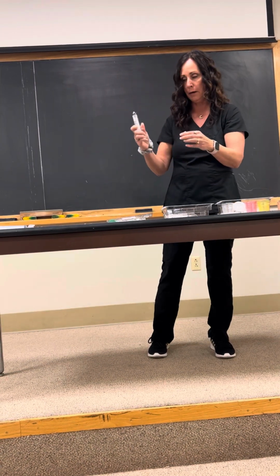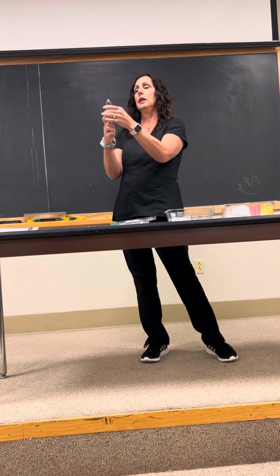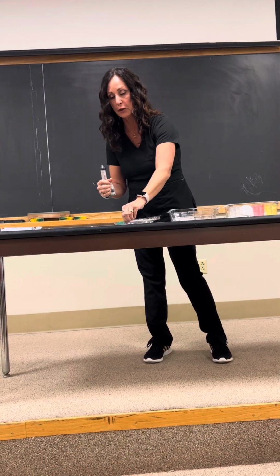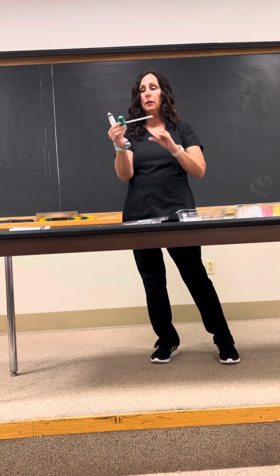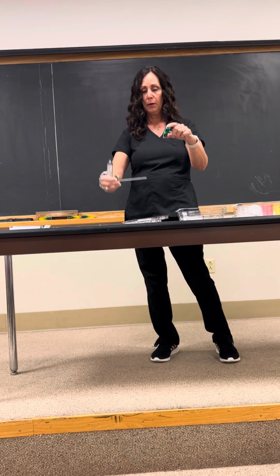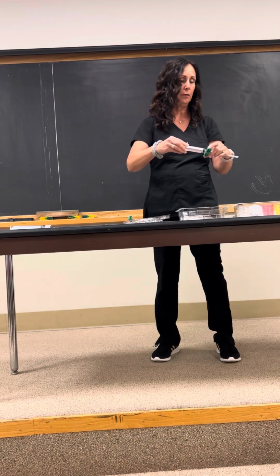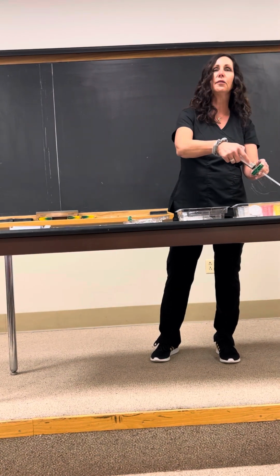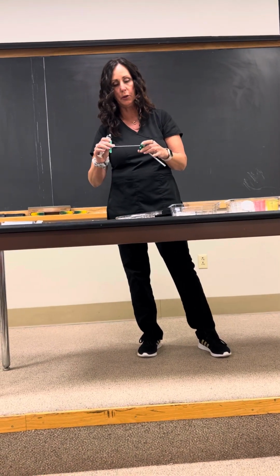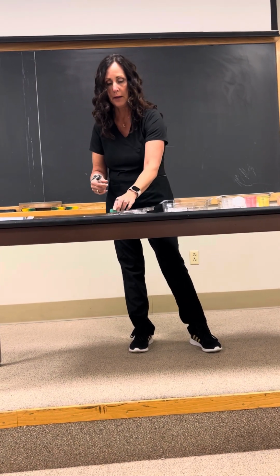Then you can probably use about 5 cc's of heparin. It's just a little bit, but you're just coating with heparin. Once you've done that, I'm going to have you flush the Jamshidi needle. This is the bone marrow harvest needle. You simply unlock, pull out the stylet, and then you're going to push your heparin back into the cup. So you're just flushing your trocar with the heparin. Then we'll place your stylet back in, and then that'll be ready to go.